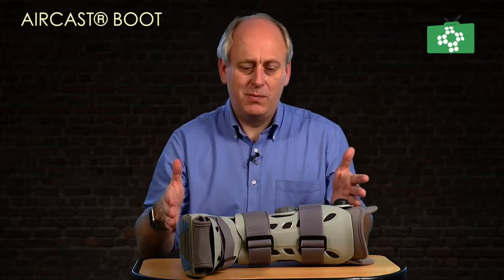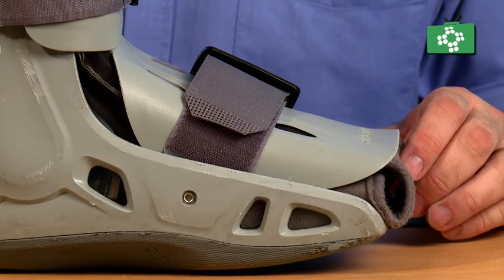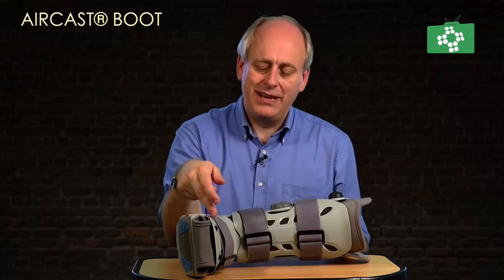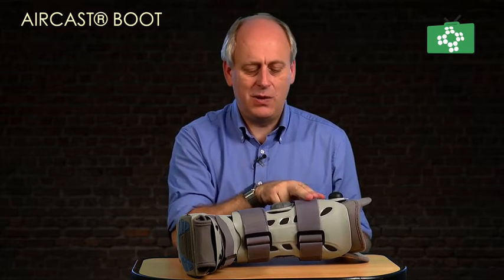Just to overview what the boot's about — there are two parts to it. There's the front section, which you put your foot into first, then you put this back section on. There are three Velcro straps, so the strap at the front holds the piece just above your foot, then the next one holds it mid, and the top one holds the top.